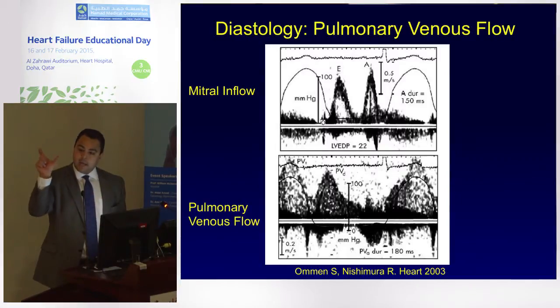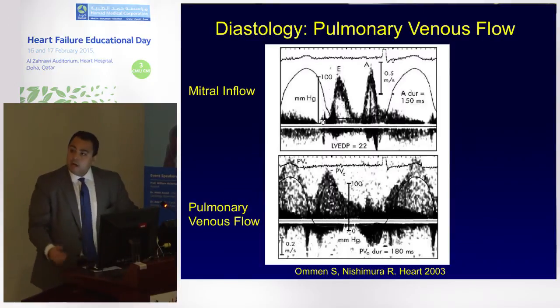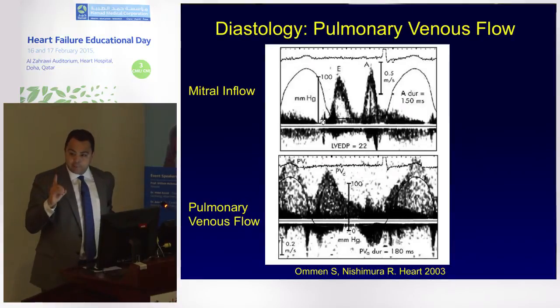So a difference in the atrial reversal wave in the pulmonary vein from the mitral A wave greater than 30 milliseconds is reflective of end diastolic pressure elevation. Why do I mention that? Another cath lab scenario. They put a catheter across an 88-year-old woman's aortic valve into the LV. The LV end diastolic pressure is 22. They say you have heart failure. But the mean LA pressure, the mean LV resting pressure in diastole, can be 8 or 9.